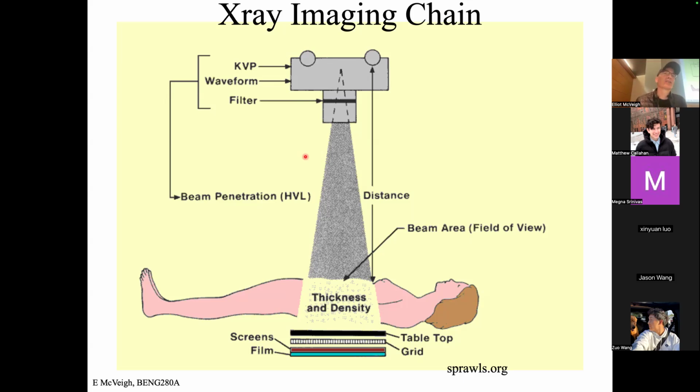My anticipation is they don't use an anti-scatter grid there because the detector is right up against the object. You are laying the object on top of the detector. If I took this person's teeth and laid them on top of this detector, you'd get a beautiful picture of their teeth. So that's how that works. That's a good question.